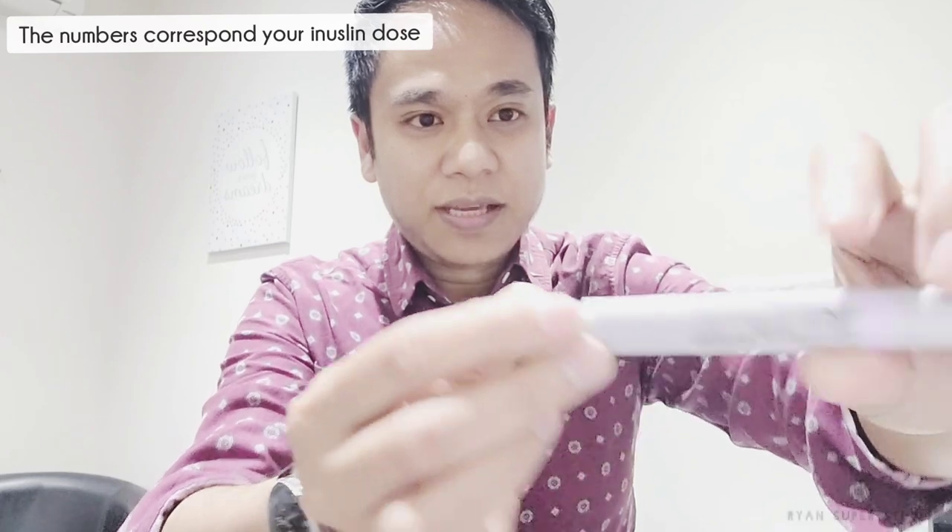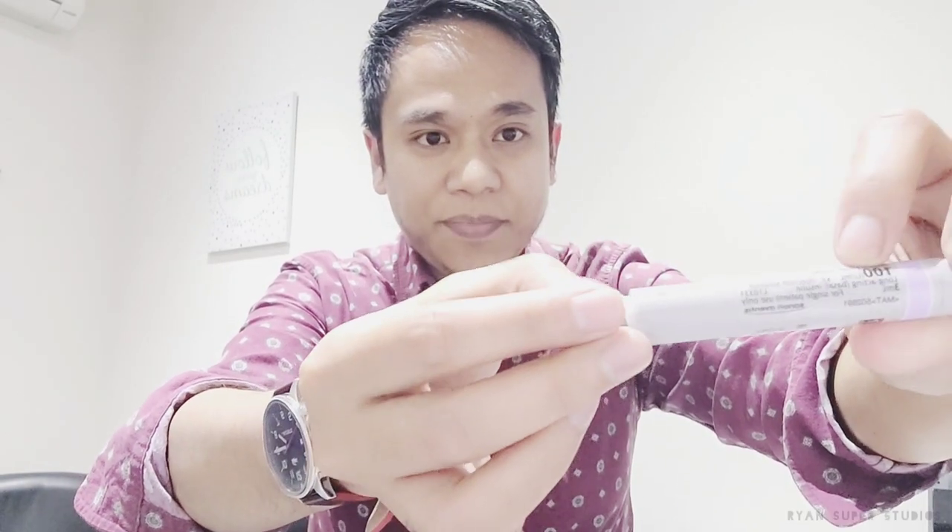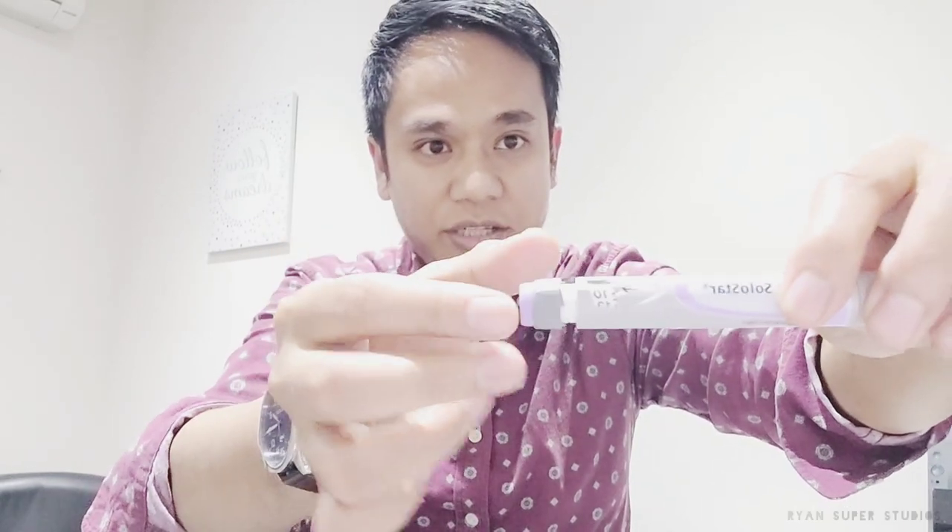The numbers represent your insulin dose. This particular one is a long-acting insulin called Optisulin — one of the common long-acting insulins. Usually the starter dose of Optisulin is 10 units, so you just dial it to number 10. The arrow should be pointing at number 10 — that's your dose.